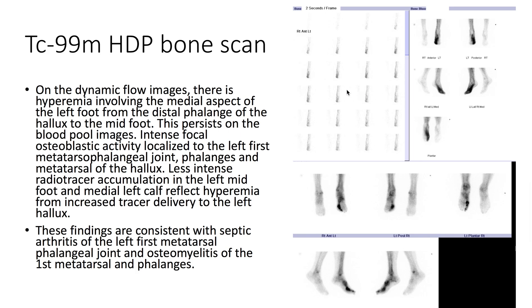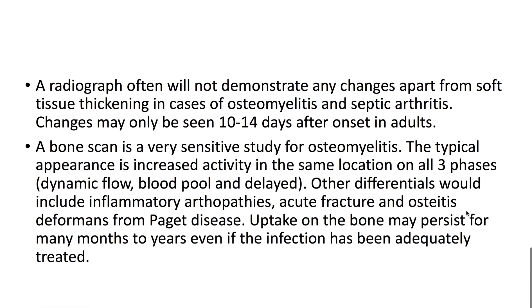On technetium-99 HDP bone scan, the dynamic flow images show hyperemia involving the medial aspect of the left foot from the distal phalanx of the hallux to the midfoot. This persists on the blood pool images. Additionally, there is intense focal osteoblastic activity localized to the left first metatarsophalangeal joint, phalanges, and the metatarsal of the hallux.